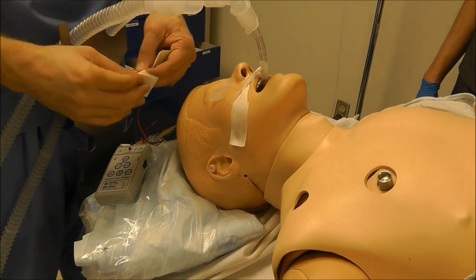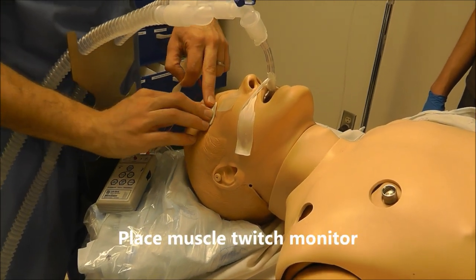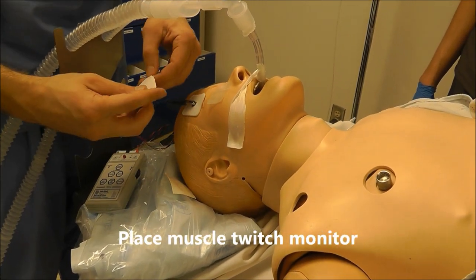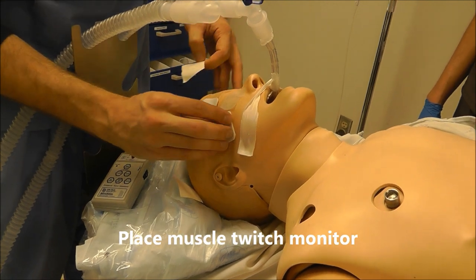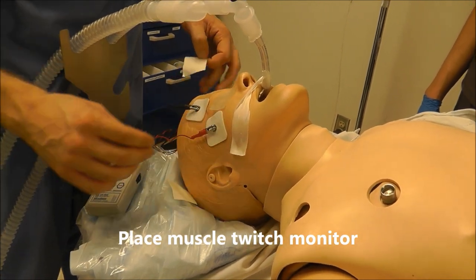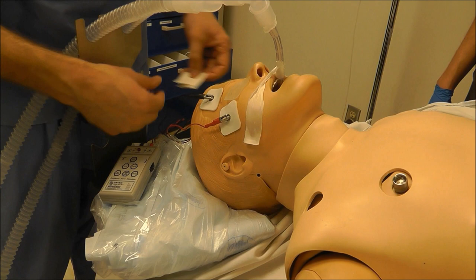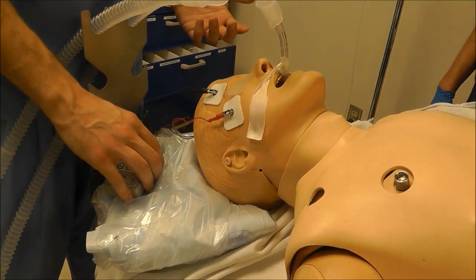As soon as that endotracheal tube is secured, you're going to want to put on a nerve stimulator, especially if you used succinylcholine, because that's going to wear off soon. You're going to want to make sure that the patient has twitches before you can re-dose your paralytic.